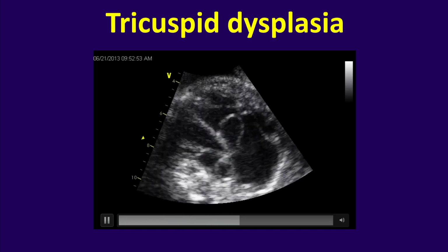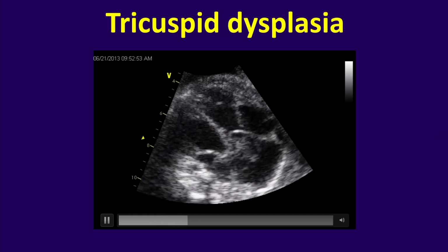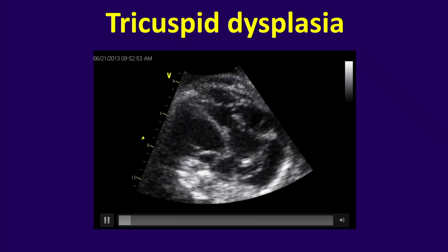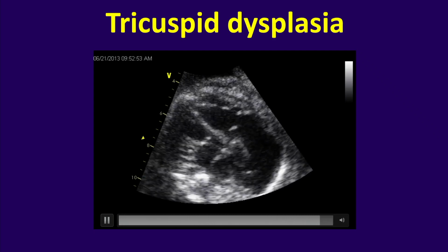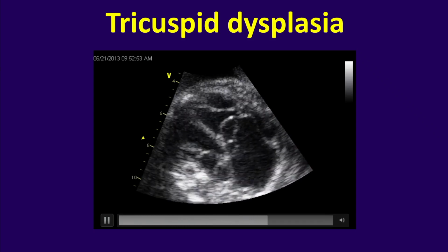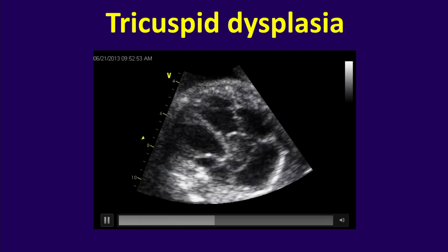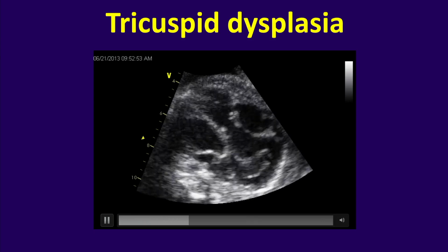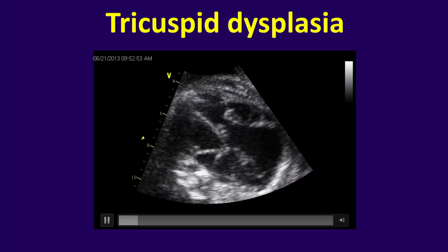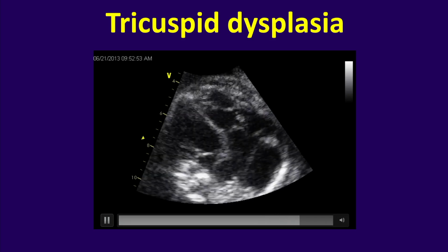It's a very often seen finding, the Chiari network, which is a structure that belongs embryologically to the formation of the coronary sinus, and pretty much this is something that develops and attaches to the Thebesian valve that sometimes can be seen in a normal heart. But this structure is basically a very thin fenestrated membrane that can be observed in many cases of tricuspid dysplasia and Epstein anomaly, and see in this case it's even protruding through the tricuspid valve. So this is a really interesting finding and should be distinguished from just the foramen ovale.